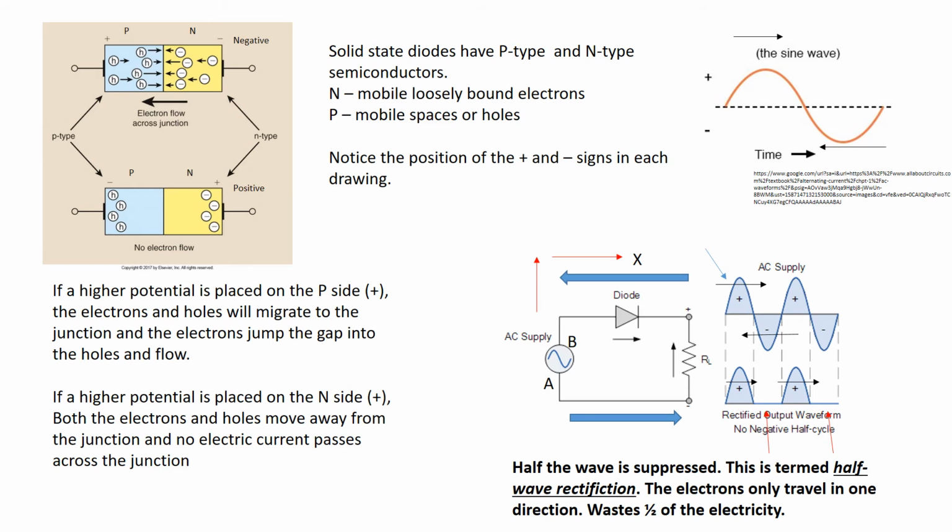I want you to imagine that the electrons are going to flow from the A and eventually get to the other side of the circuit, the B. So as the electrons start to flow, they flow through the resistor. And remember, what did we learn about a diode? Electrons can flow against the arrow. So the electrons continue on their way until they get to position B. That basically then would put the first half of the cycle on a drawing.